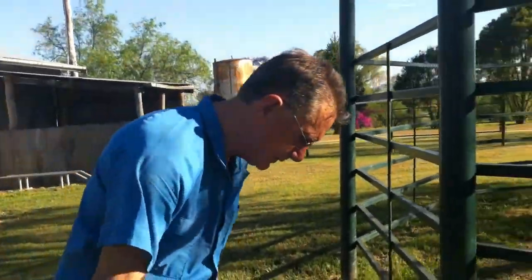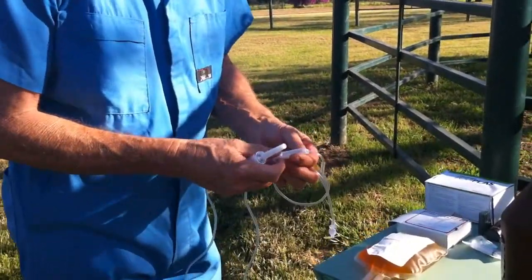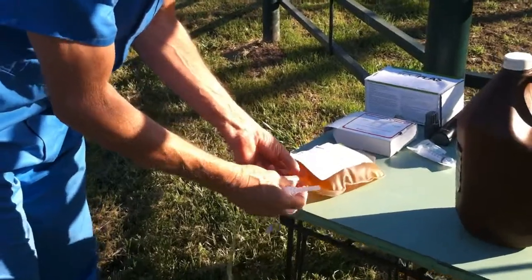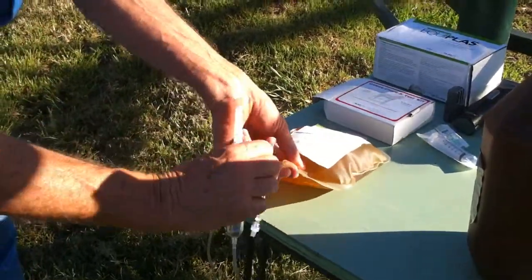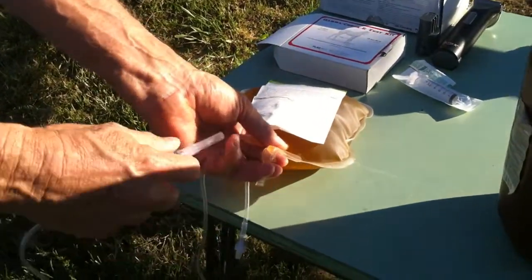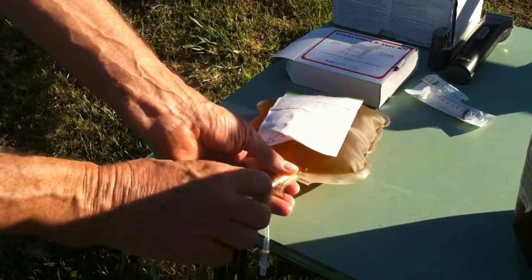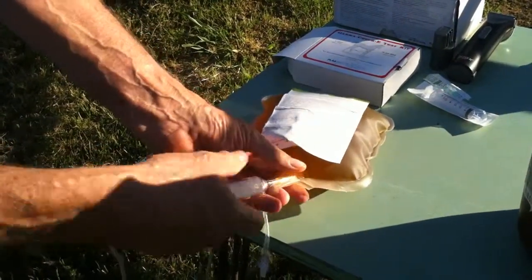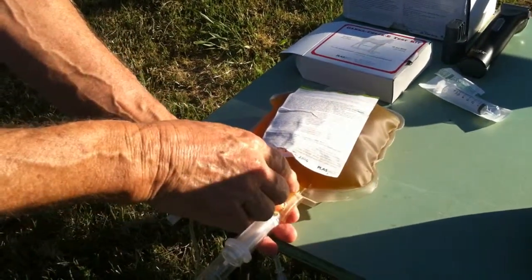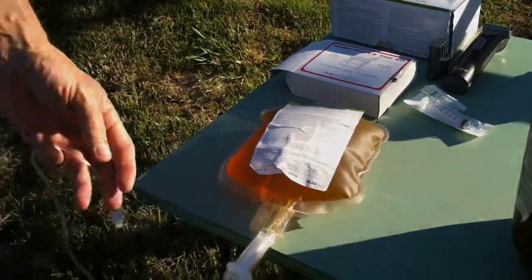So what we do now is we turn the giving set off first, because when it comes out of the pack it is open. We turn it off. We expose one of these transfusion ports like that without touching it — just hold the flap open. We take the cover off the giving set spike. And we push this in, twisting it at the same time. It's very important to twist as you push it in, so that you don't penetrate the side wall of the bag with the spike. If you use a twisting action, you won't do that.